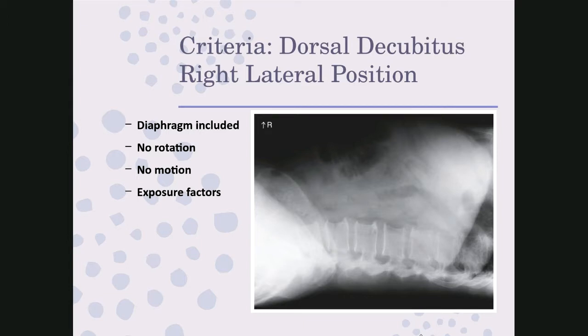And sometimes what they'll do this for is after the patient has a AAA repair in the OR. Remember, a AAA is an abdominal aortic aneurysm. So sometimes when they repair that aneurysm in the OR, they'll actually send the patient down to radiology to have a dorsal decubitus view done to make sure that they can visualize the repair to the aorta. Usually you'll see a kind of mesh covering where the aneurysm was or is. They'll usually just evaluate that after surgery.